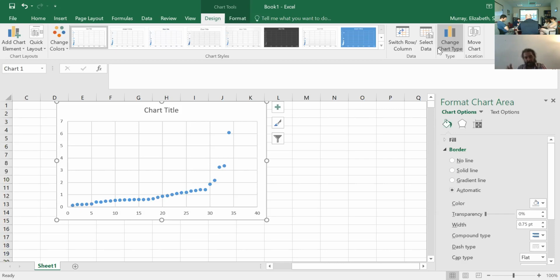And once you figure out which variable you want to use as a control covariate, then just change your second level analysis: instead of using the motion covariate, use the covariate that we found to be most explanatory of the variability. Again, do the same thing, divide it into a covariate per group so that you can then look at the average effect within each group, controlling for that. So just treat it as seeing if we can find a better control measure than average motion, basically. Okay. Yeah, that makes sense. Yeah, for sure.